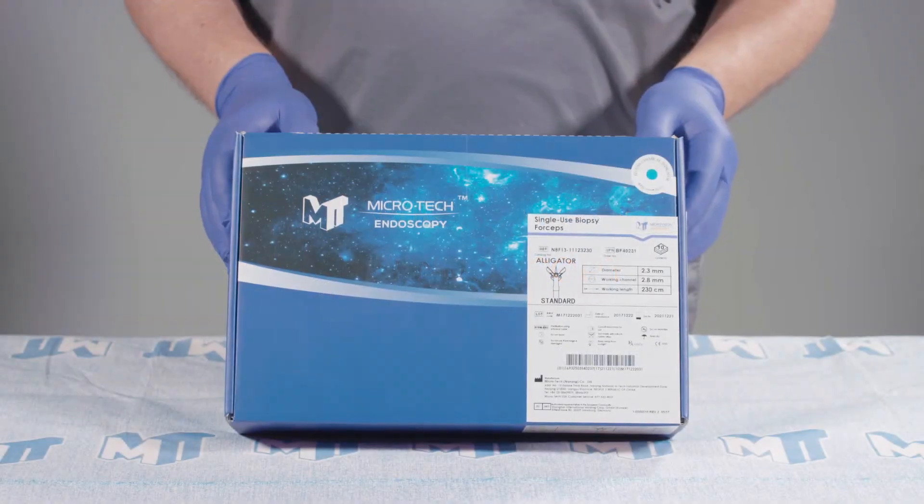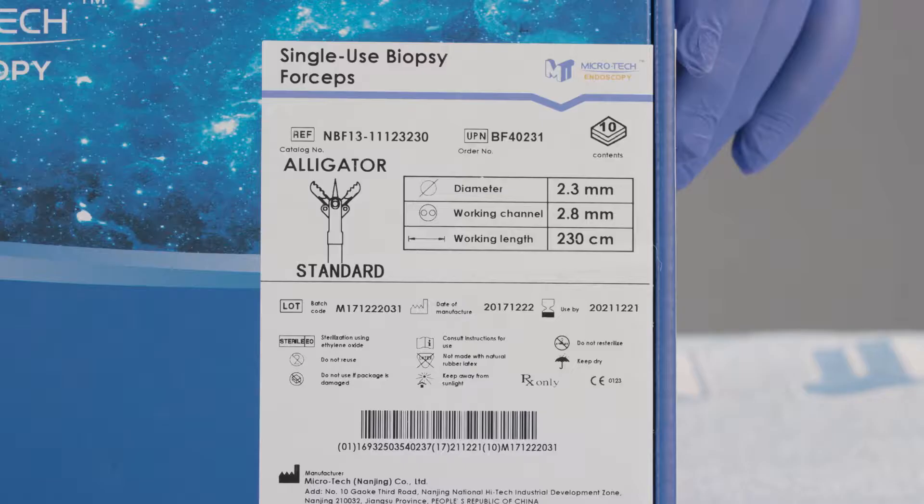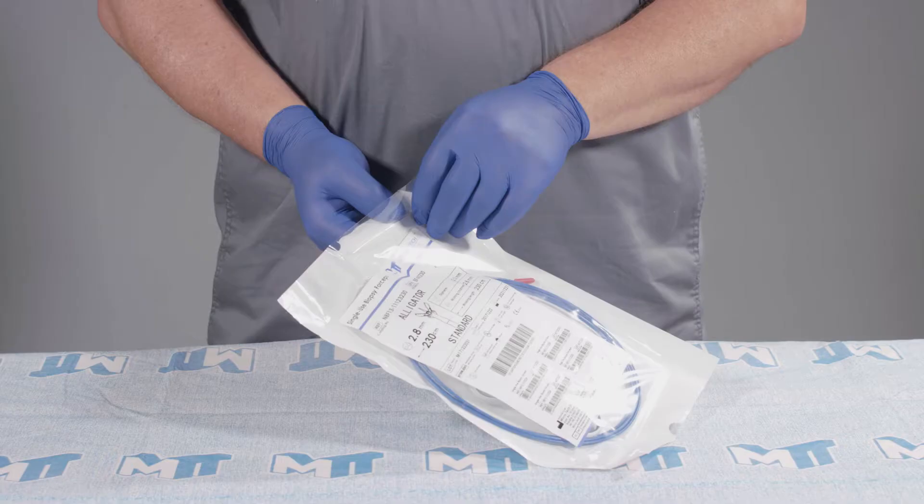Microtech single-use biopsy forceps come packaged sterile, 10 or 50 per box. The labeling includes the order number, the product size and specifications, date of manufacture, and use by date. Each set of forceps is packaged in a plastic peel pouch.